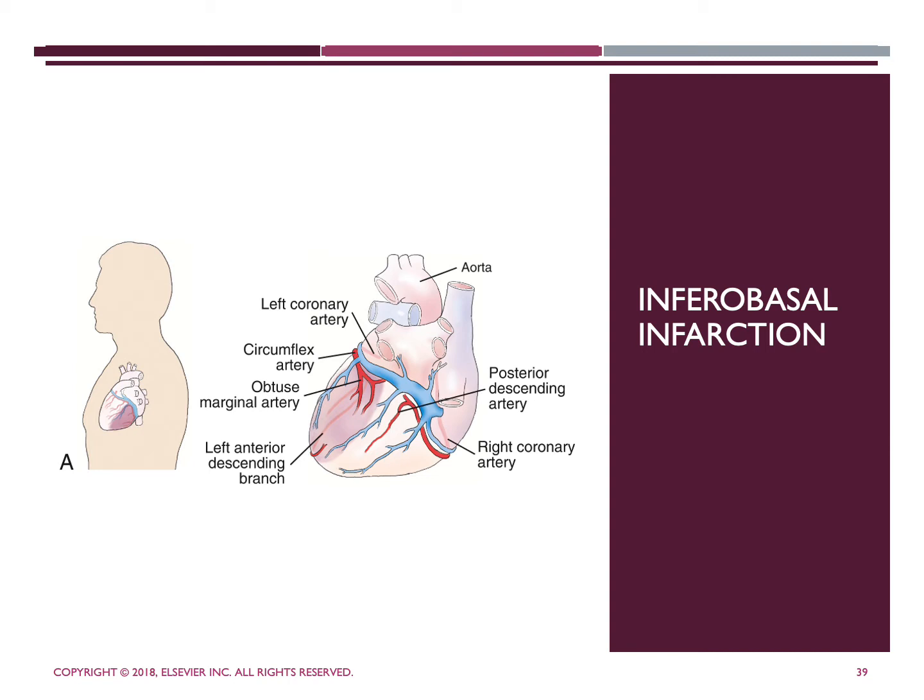So the inferobasal, or what is also known as the posterior infarctions, usually occur in conjunction with an inferior or lateral infarction. So the inferobasal wall of the left ventricle is supplied by the circumflex artery in most patients. However, in some patients, it is supplied by the RCA.